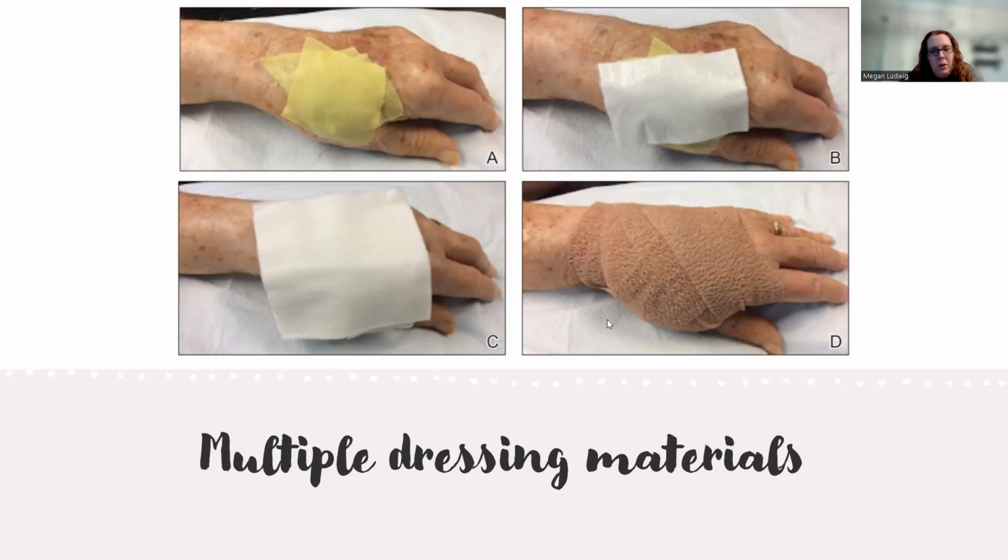And then it's secured in place, because this one doesn't have any sticky to it, with Coban, which is self-sticky to itself. That was probably the best choice here because it's really going to be hard to tape something so big right here, especially on what appears to be an elderly patient's hand.